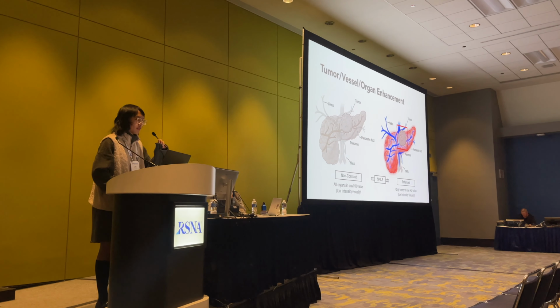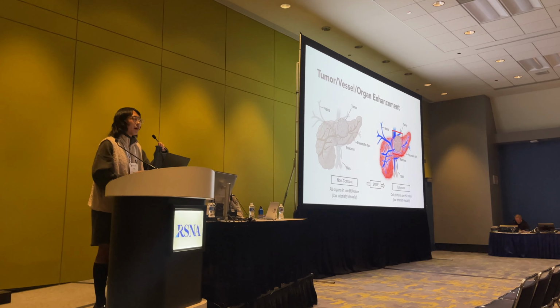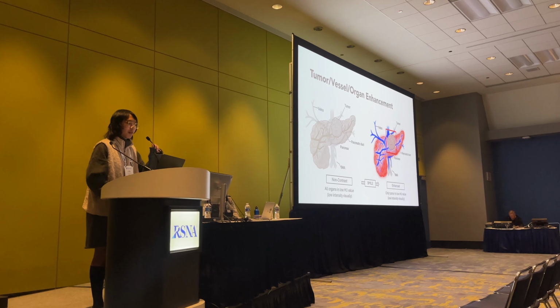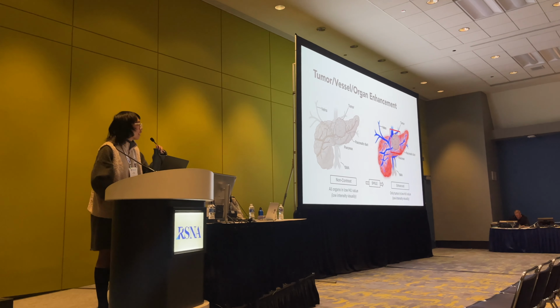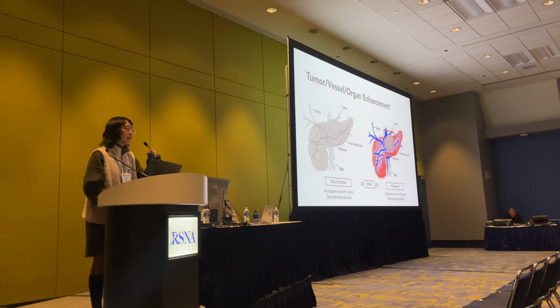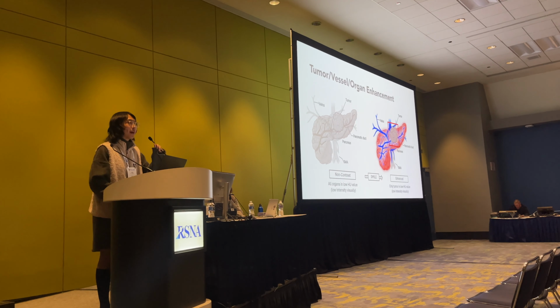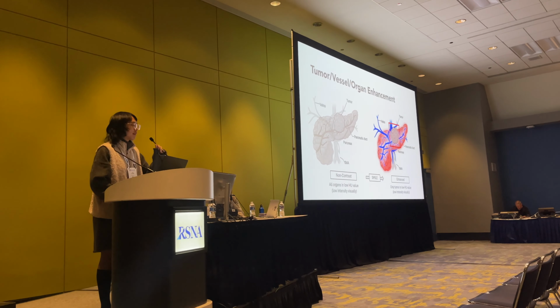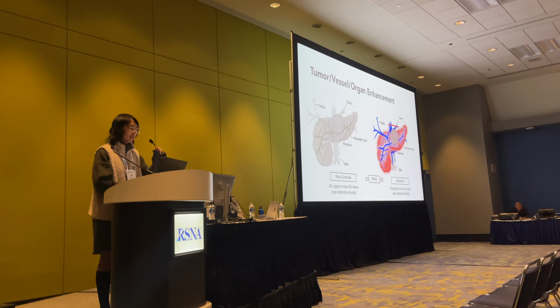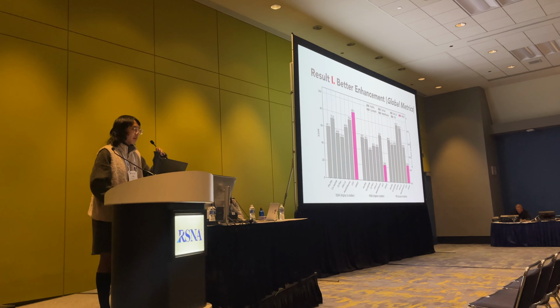The core part of our system is that it can enhance the tumors or make them very visible or detectable during the enhancement. Here is an example of a non-contrast CT where all organs have low attenuation values. After the enhancement, only the tumor remains at a low attenuation value, enabling us to do the detection of the tumors. This is the result shown of our project.